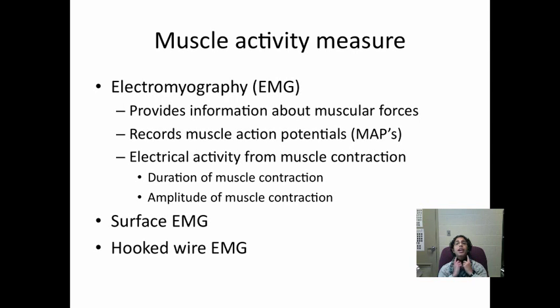A lot of people have used EMG activity at the level of the vocal folds, mainly the intrinsic muscles of the larynx, specifically to do with Botox treatment. If you've ever heard of spasmodic dysphonia, basically where your vocal folds spasm and you produce speech with a strain, like the breaking spasm that you hear. People do EMG to understand that they're targeting the right muscle group to put the Botox in, so they can kind of paralyze that muscle, so there are not as many spasms and your vocal folds don't contract so much.